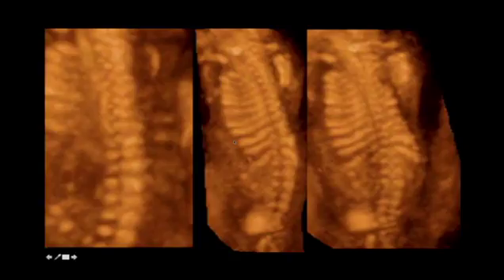And you can look in 3D and find also the very short ribs. And what you see here in 3D is the platyspondyly. So the very, very small vertebral bodies, these are the vertebral bodies here. Look at how small they are. And very, very typical of this abnormality.